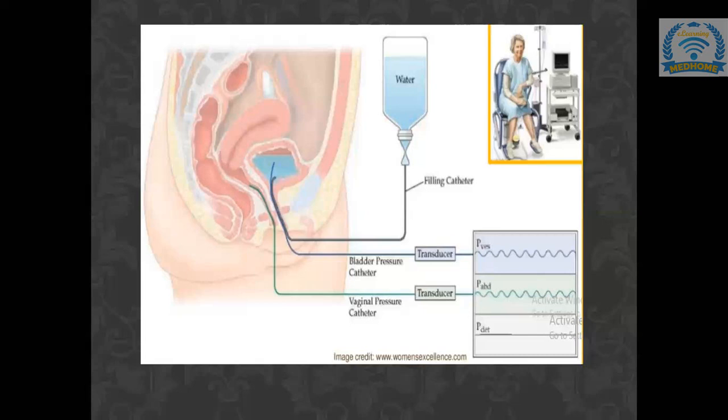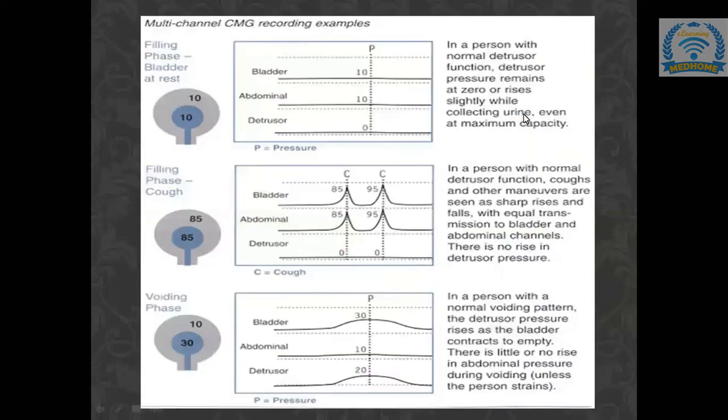Now, how do we identify? In the monitor there will be graphs formed. How to study that graph? We are going to learn today. Now, what happens in the filling phase when she is at the filling phase of the bladder at rest? What happens in that?